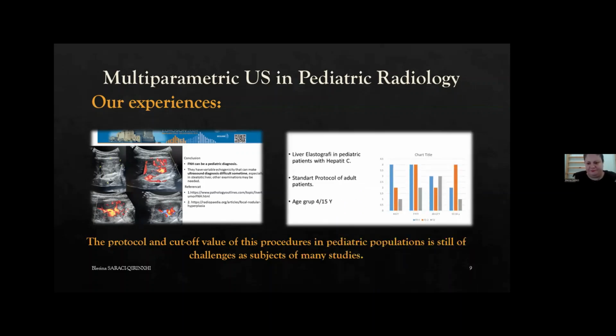This is another presentation that we gave at the same meeting, where we presented our study. We have around 30 young pediatric patients with hepatitis C, and we performed a standard protocol for the stiffness of the liver, to evaluate liver stiffness.